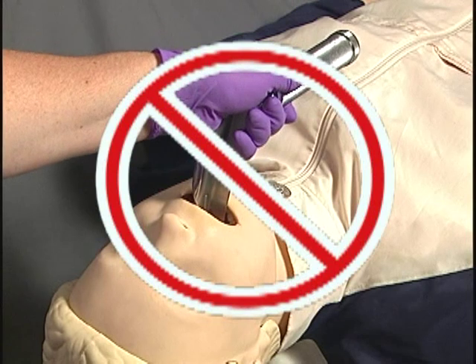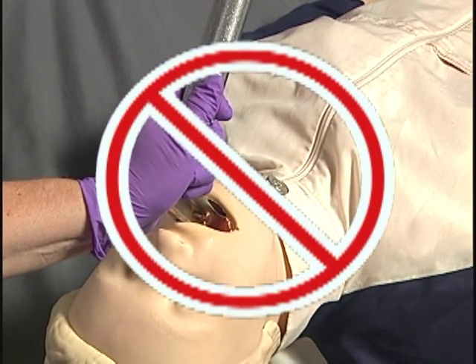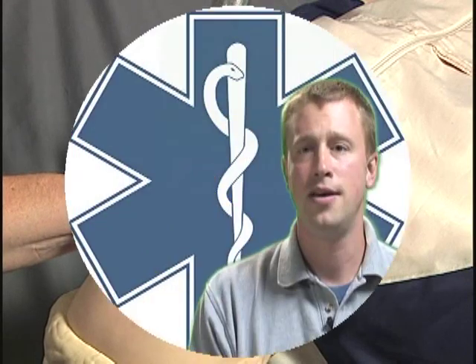Some important points to consider when using these tools include the use of proper body substance isolation or BSI. Use the skill on only unresponsive patients, and never use the laryngoscope as a lever or fulcrum against the teeth or mouth. Improper use of these tools can lead to significant injury and can damage the patient's airway structure.